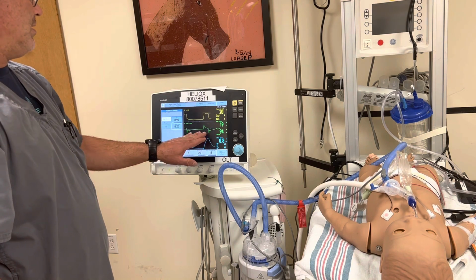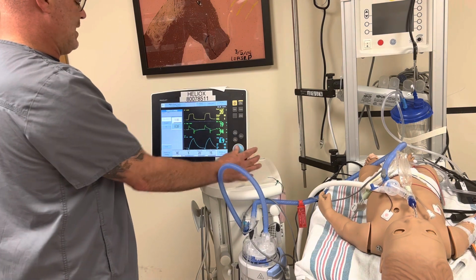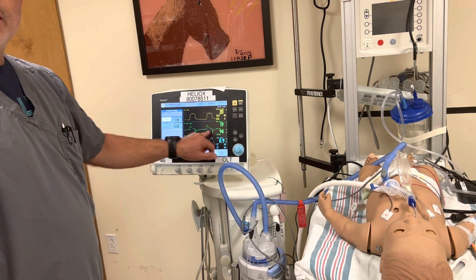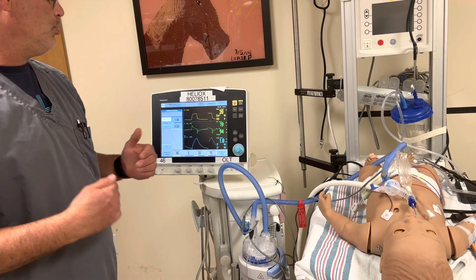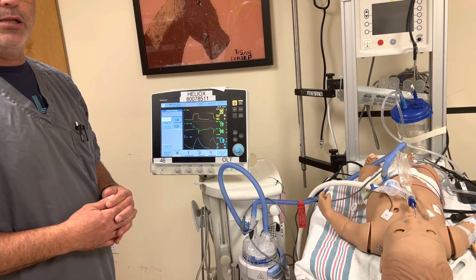So I'm getting there finally, right? Now at 0.95, maybe even 1 second, which kind of caps out the leeway we have with this 1-year-old, I get to zero flow on my waveform. This is vital because we're really good at looking at how much volume per kilo has moved on the patient and targeting that. Usually we target it within the 6 to 8 per kilo range.